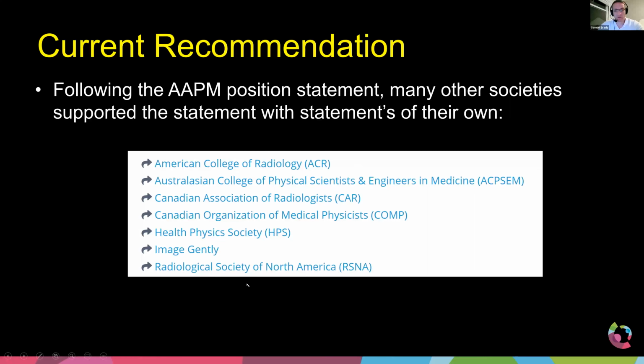So these groups, all of them, came out with their own statement, and they said basically the same thing. They said, we agree with the AAPM. We also believe that we should discontinue using gonadal shielding.